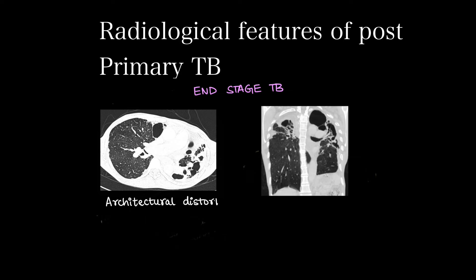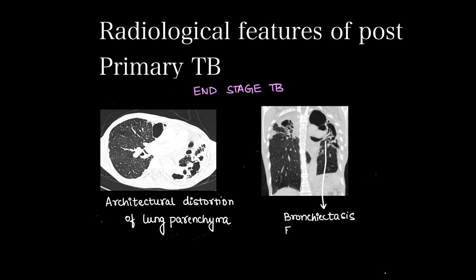End stage tuberculosis shows architectural distortion of the whole lung parenchyma. Other changes include bronchiectasis, fibrosis, and collapse.